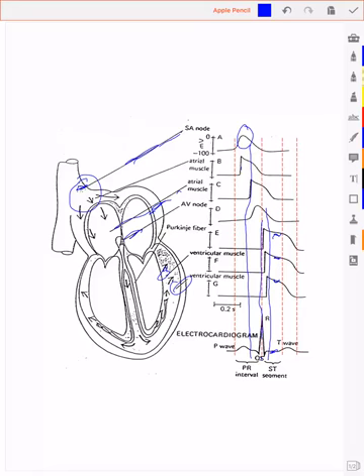And then finally, we get repolarization of the ventricle, and these ventricular cells repolarize, and that lines up with our T wave. So the T wave is repolarization of the ventricle. That's my quick round the horn on the ECG, my easy blob introduction to it. And now I think you're ready to go into Dr. Shah's stuff and see his introduction from a clinician's point of view.